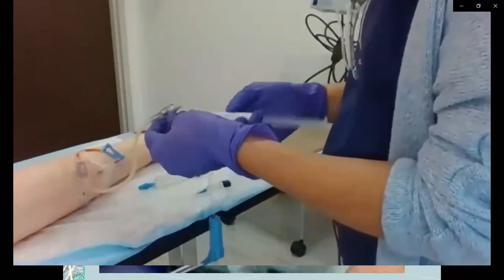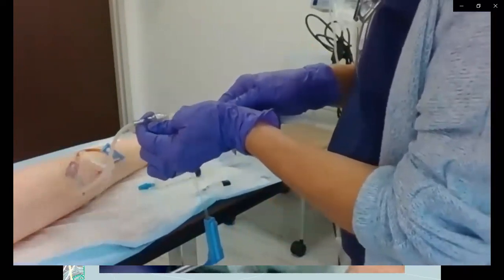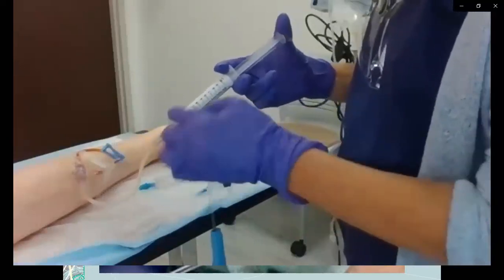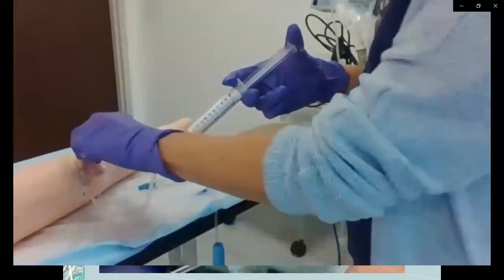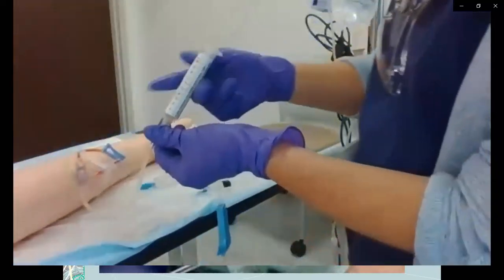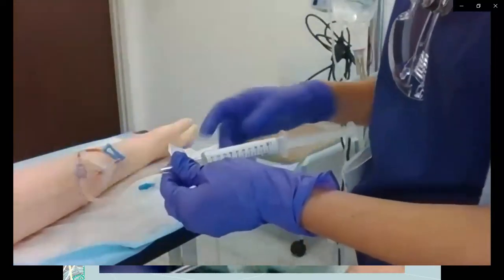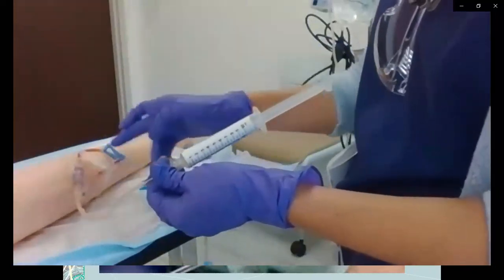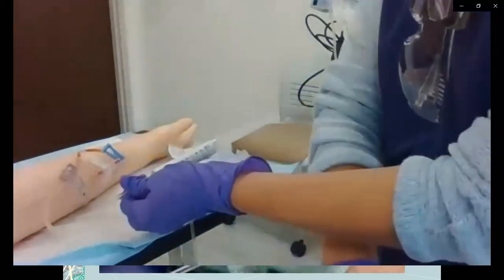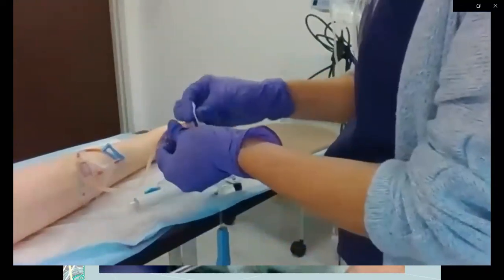Okay. We're then going to cleanly use our syringe, our saline flush, attach it. We're going to flush that. We want to clear that line of all the medication that's in there. I'm not going to clear it because of this mannequin, but you're going to flush with that. If you are going directly into this hub, you don't need to use quite as much. You could use like 5 cc's versus the whole 10. Okay, so we have flushed. We're going to clean.